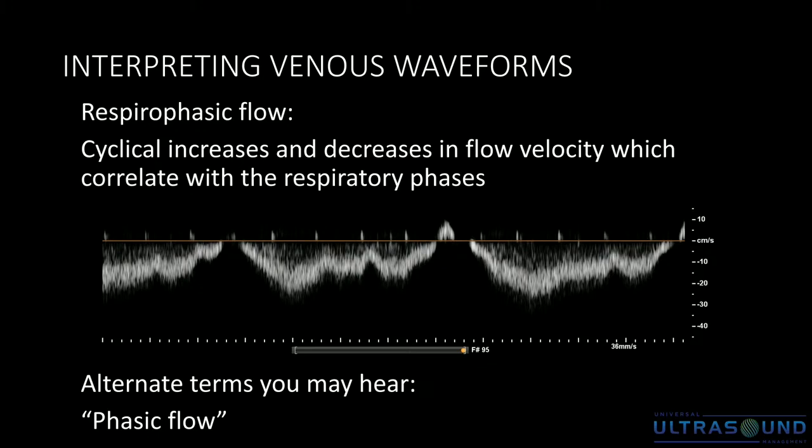So what do I mean by if I can't see with B mode? There's something that we can do before we even place the transducer on the patient's abdomen, and that's looking at the Doppler waveforms at the common femoral level. The waveforms can give us a lot of information on what's happening in these outflow veins. Also, comparing the contralateral waveforms can indicate if there's pathology proximally that makes us want to investigate further.